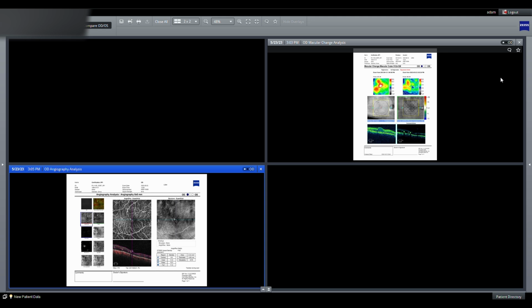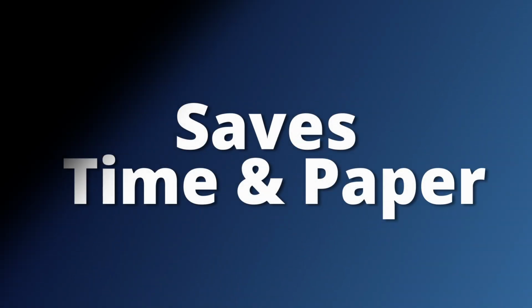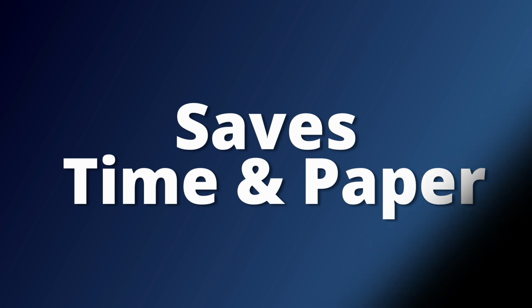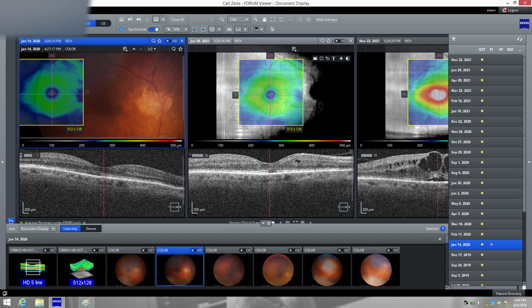The reason why we wanted Forum was we wanted to switch from paper printouts to computers so that nobody has to walk to another room with the printouts. And again, it was super useful that if you had multiple visits with multiple imaging, you didn't need to go through them all one by one. So in the end, we were able to save 40 minutes a day.